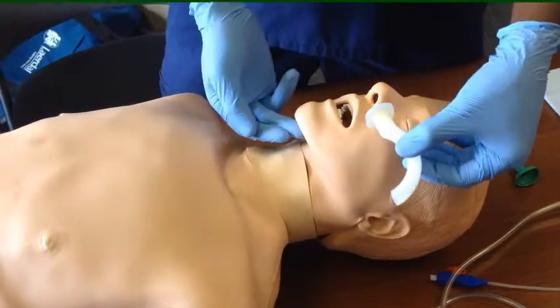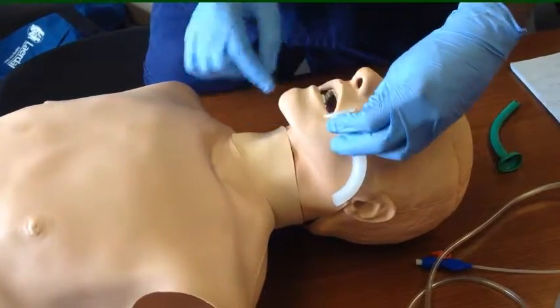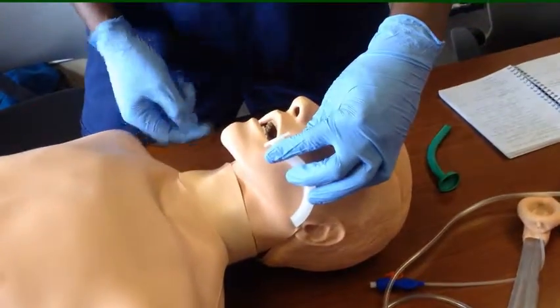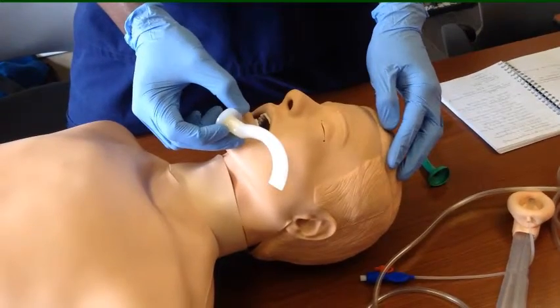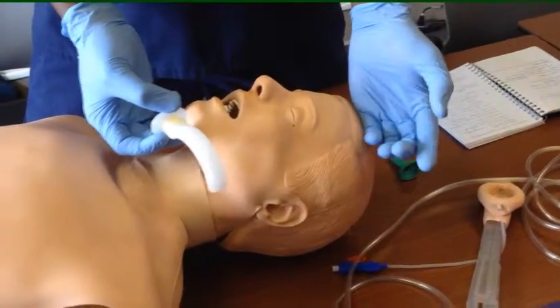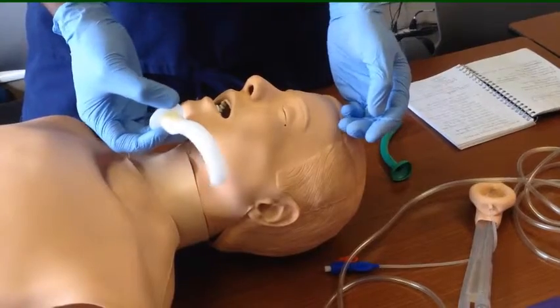So in this case, for our patient, Mr. Patient, if you put the OPA, you see from the edge of the mouth to the corner of the jaw, it's exactly fitting. So that means once you put it, it's going to be the perfect one for this patient. Because if you put a short one, you'll not be able to get the results you wanted, to take the tongue off the back of the throat.